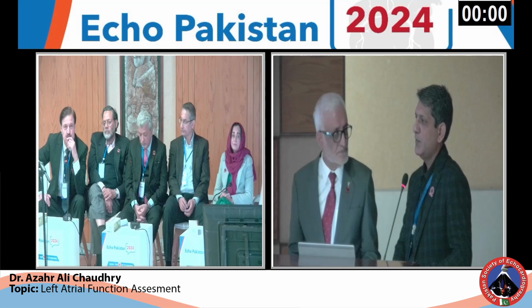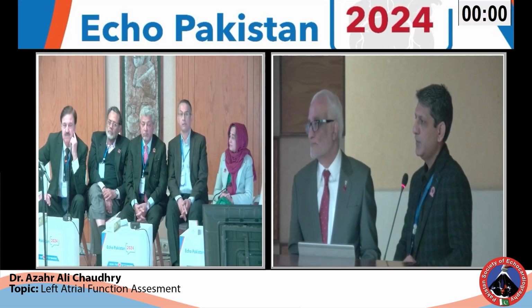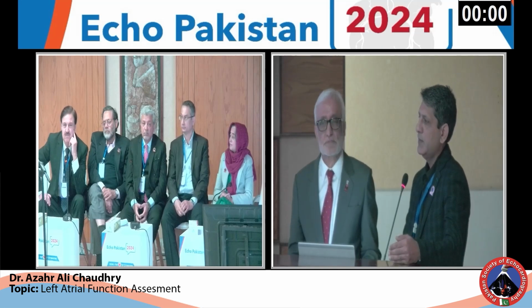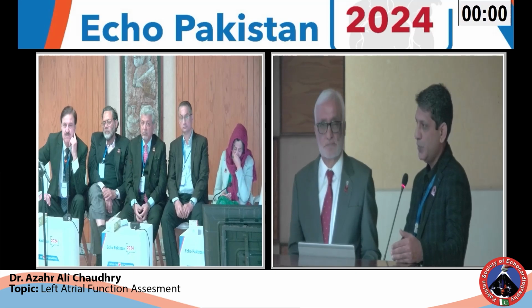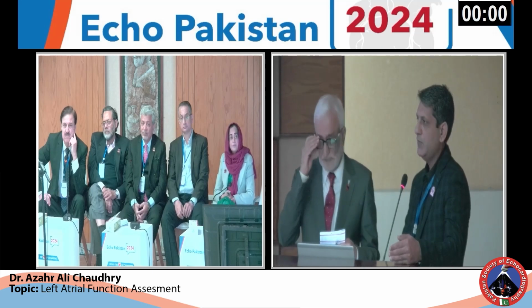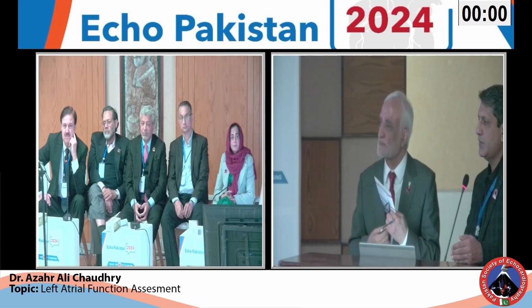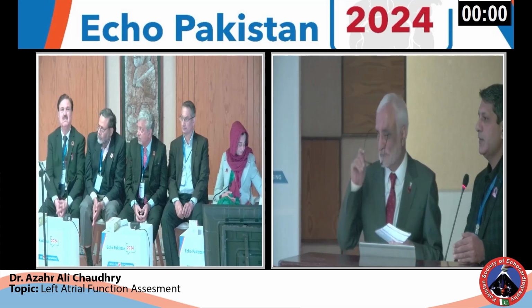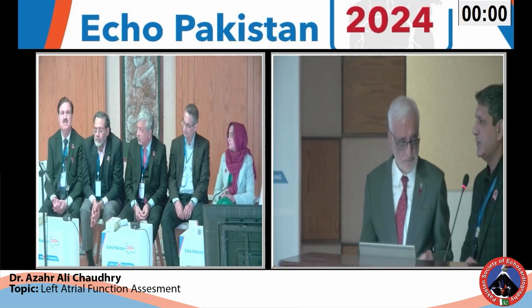Yes, sir. That is why the left atrial volume index has superseded all the previous measurements. Left atrial volume index on 2D is inferior to 3D, and 3D is inferior to CMR. CMR is the gold standard, and 3D biplane is closest to the CMR. Between 2D and 3D volumetric assessment, there is a difference of 5 to 8 ml per meter square. So the area, 2D and M-mode measurements are not recommended in the guidelines for assessment of the left atrial size.